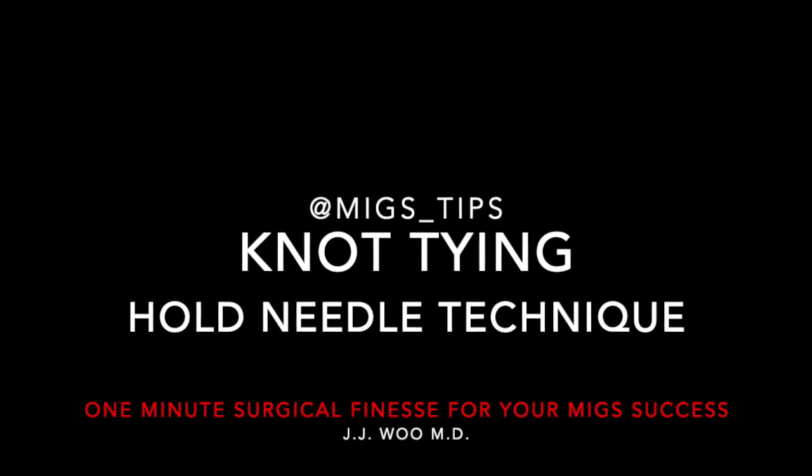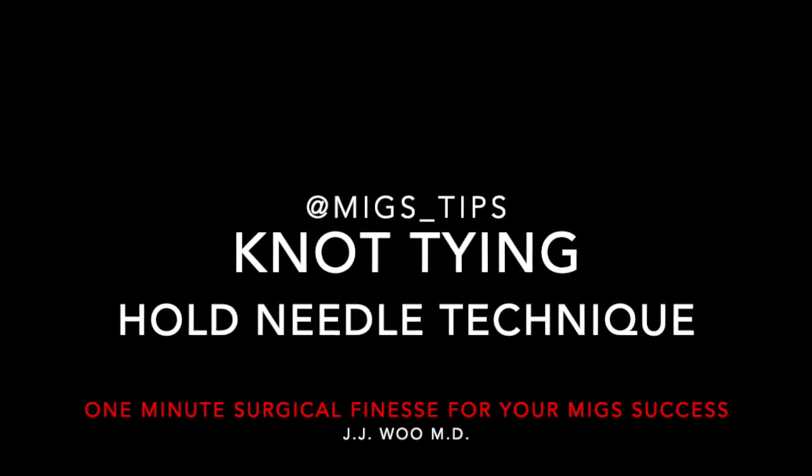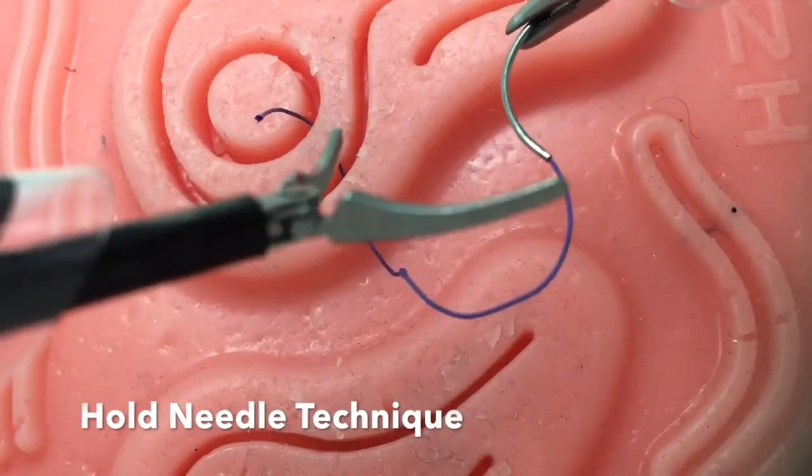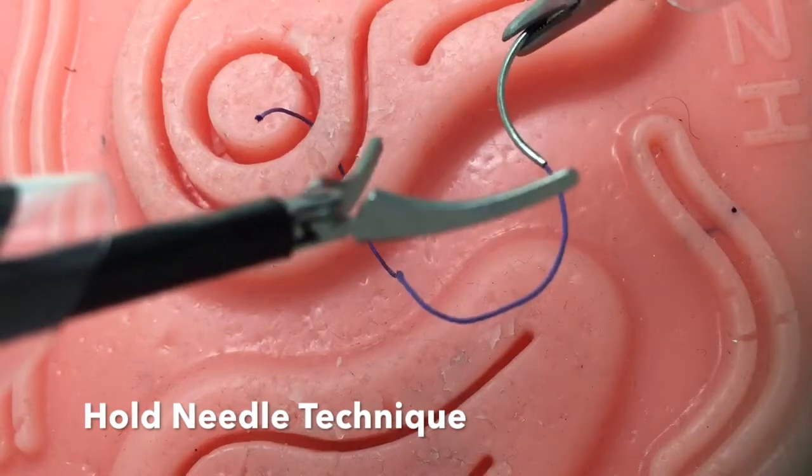Knot tying: hold needle technique. This technique may be beneficial with shorter sutures. In contrast to the drop needle technique, here the needle is constantly held.